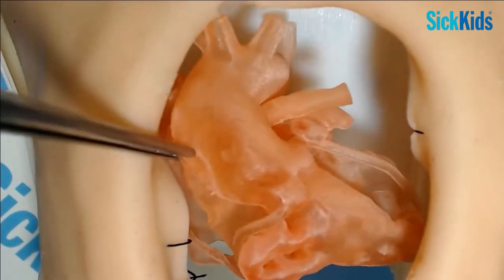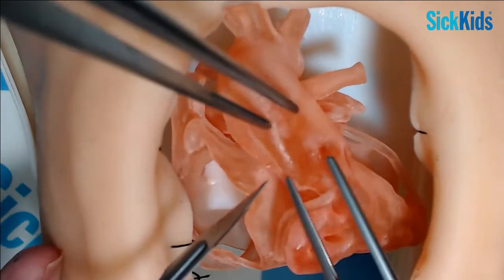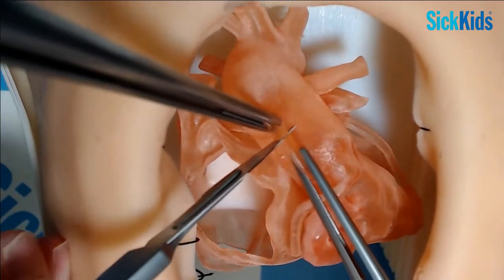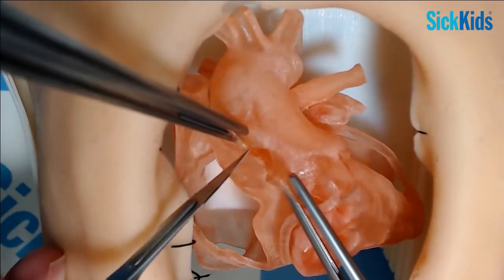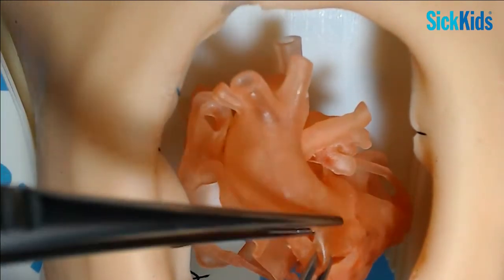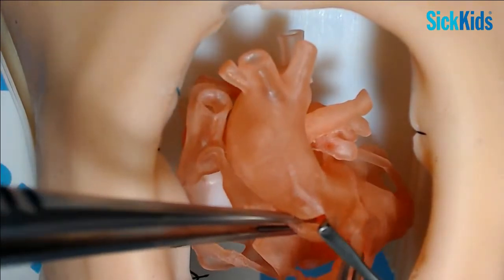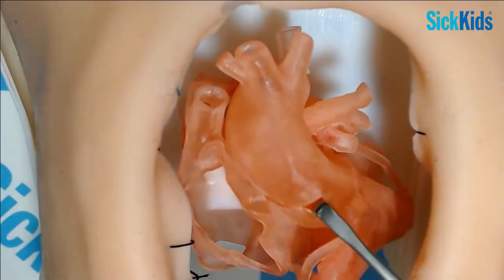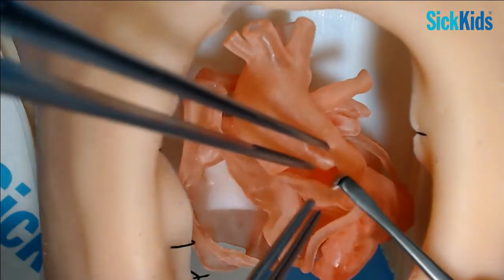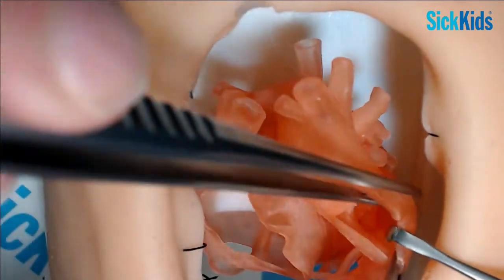Because if anything they're slightly more orientated towards the right side, towards me, the first thing I would do is just open the trunk, but you have to open it carefully, and just open a little bit first and have a look inside before you dive in and do anything, because you've got to see where the coronaries are. Here in the model it's beautiful because you can see them very obviously, but often in a baby the trunk is short, you can't quite see the coronary ostia very clearly, so you want to be quite sure that you have a good look inside before you go somewhere that you shouldn't.